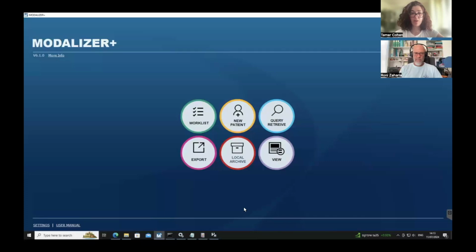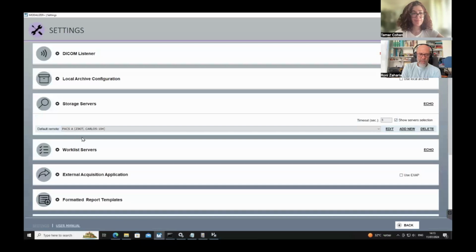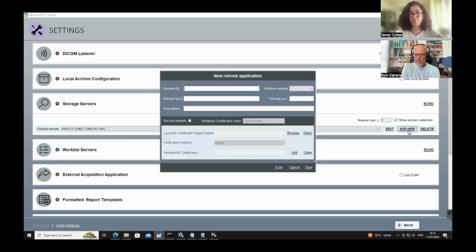Okay, so we can see the home screen of Modalizer Plus. Where do I want to go? Let's go to the settings. Go to the storage server, and click add server, add new. So, what should I start with?